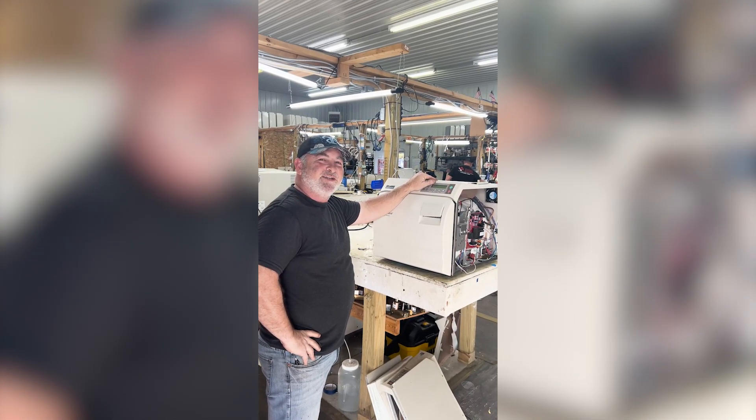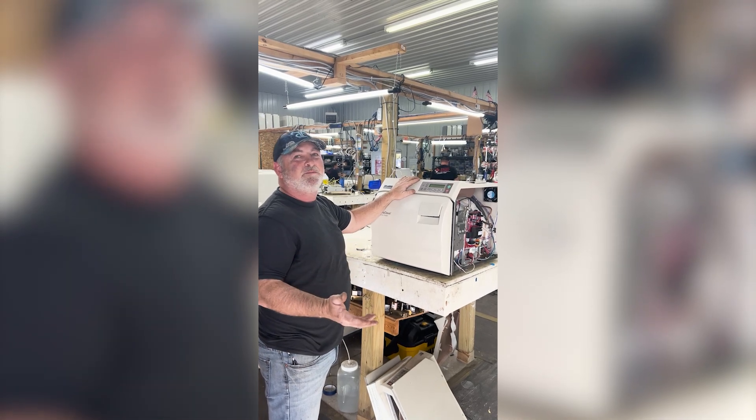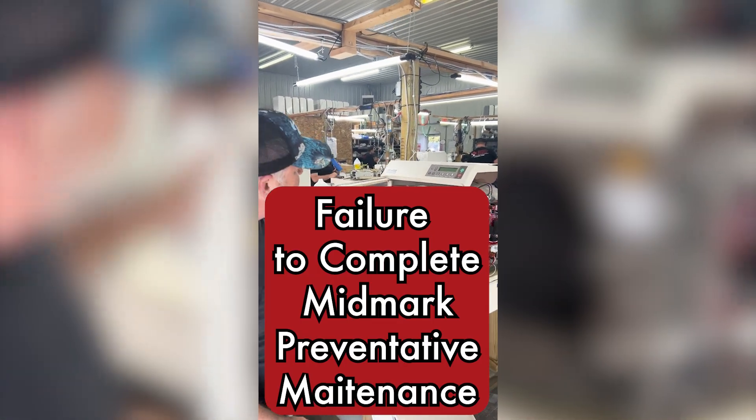Hi, this is Ron with Sterilizer Autoclave Solutions. Today I've got a Big Mark M11 New Style. Now this is going to apply to any old style M9 or M11. So we're going to talk about what goes wrong when you fail to do your routine maintenance.